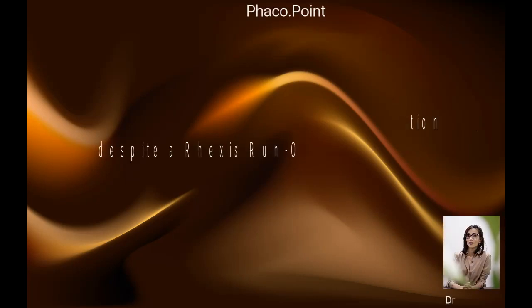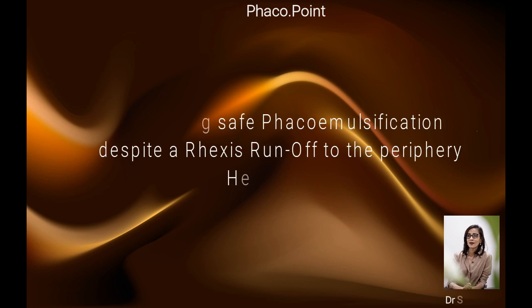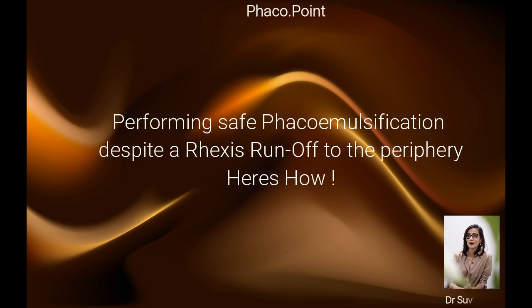Once you have had a compromise in the rhexis — that is, if the rhexis runs off to the periphery — you no longer have a stable capsular bag to withstand the forces of phacoemulsification. Any steps that take place thereafter come with a risk of the rhexis tear extending into the posterior capsule.